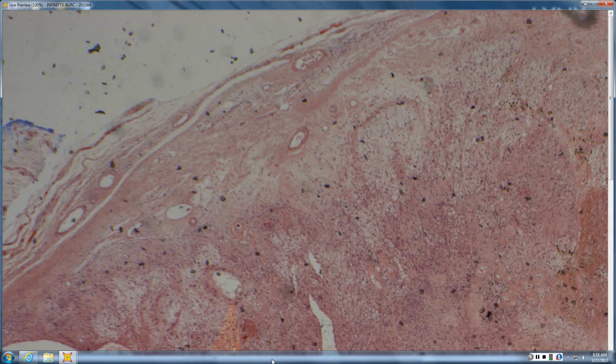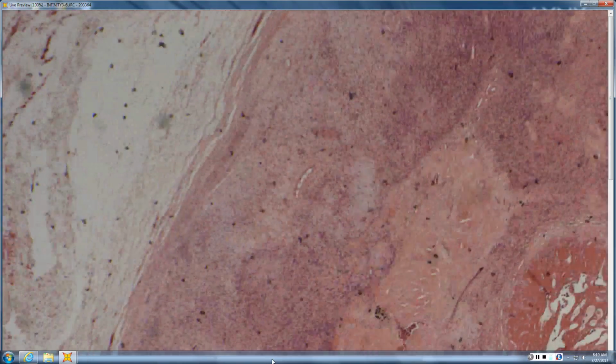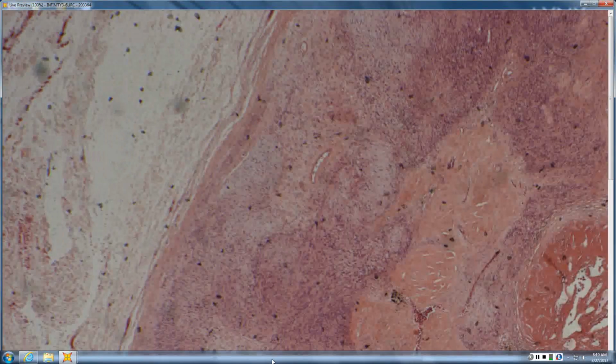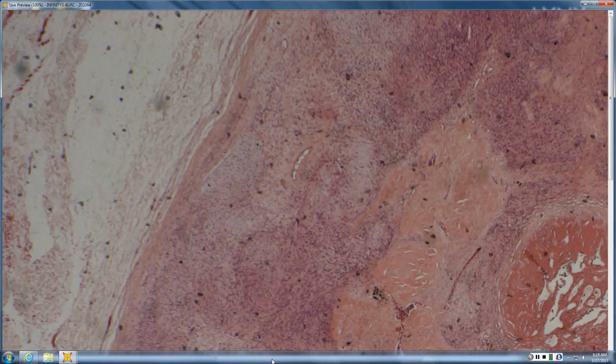Schwannoma, exactly. And then does it have the more edematous tissue to the outside and the denser tissue to the inside? And then you start to look, can I make out any palisades in the center? But the basic architecture, this one is not that well palisaded. Doesn't have great Verocay bodies, but it's a deep encapsulated tumor with subcapsular edema.